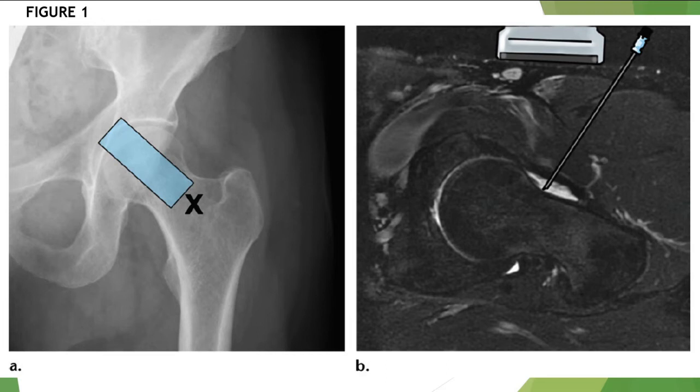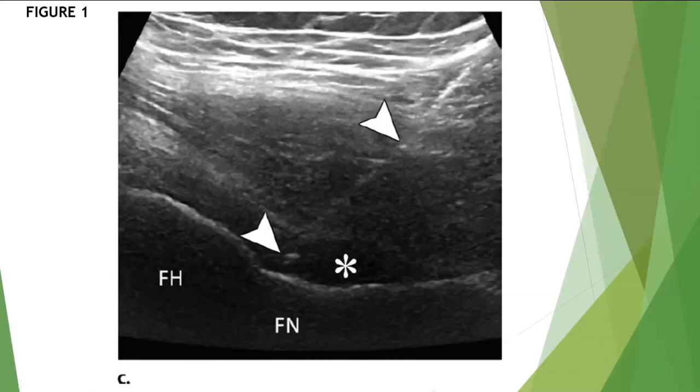You see here the neck, the head, and here the intertrochanteric area. So this is the anterior part again, and we should be reaching this greatest concavity. So here you have another figure. It's from the same series.